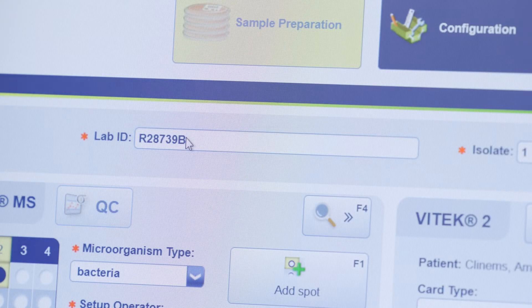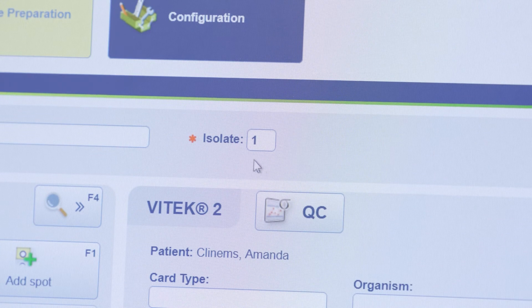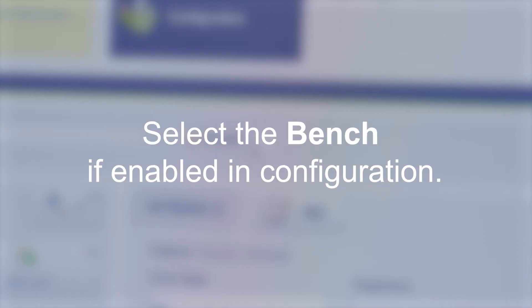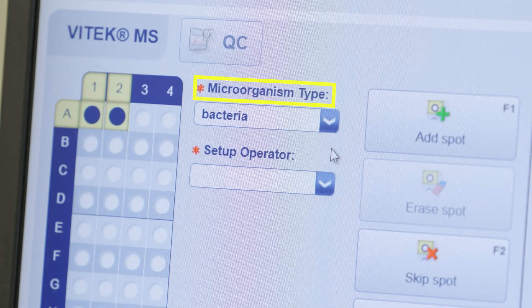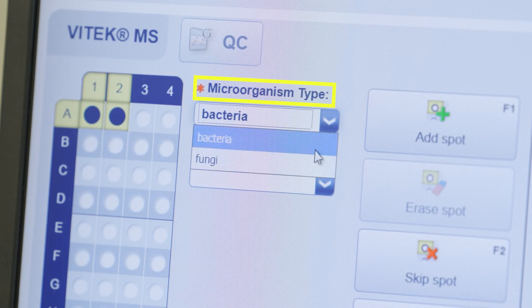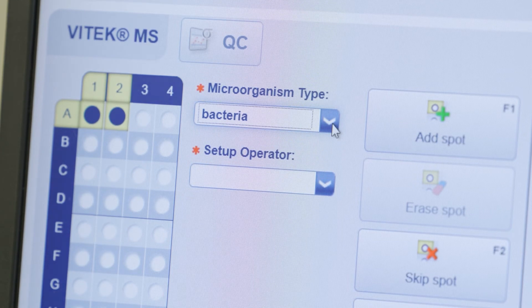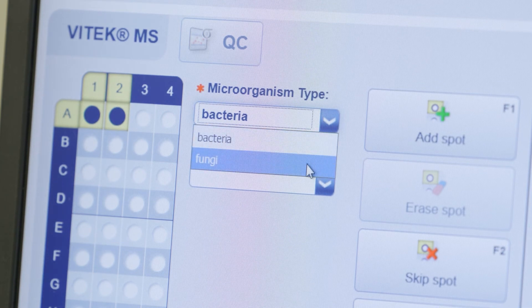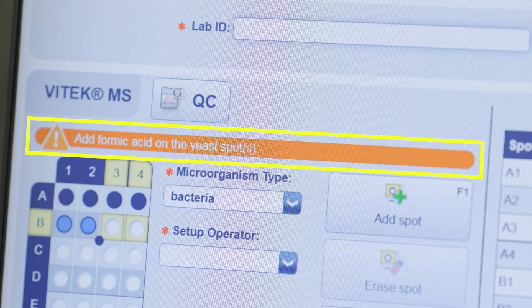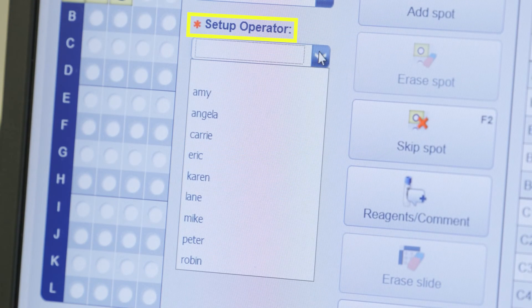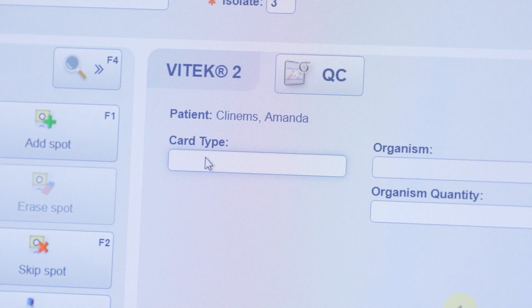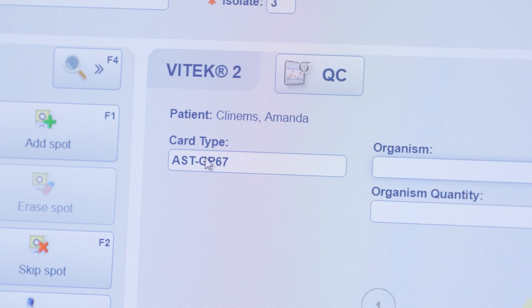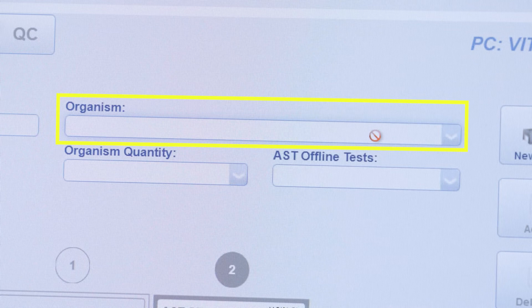Scan or type the lab ID into the lab ID field. The isolate number may be manually edited if necessary. Select the bench if enabled in configuration. Verify the correct option is selected for bacteria or fungi under microorganism type. Spots defined as bacteria are displayed in dark blue; spots defined as fungi are displayed in light blue. Note, you will receive a reminder to add formic acid to yeast spots when running fungi. Select Setup Operator if configured. Ensure the Vitec 2 card type field is selected, and scan the desired Vitec 2 card barcode. Enter remaining information for the Vitec 2 card as applicable. An organism ID is not needed if pairing with a Vitec MS sample.